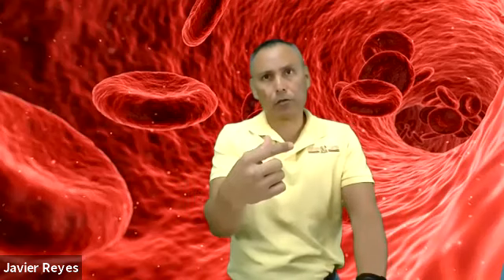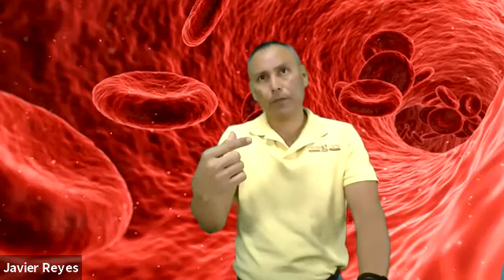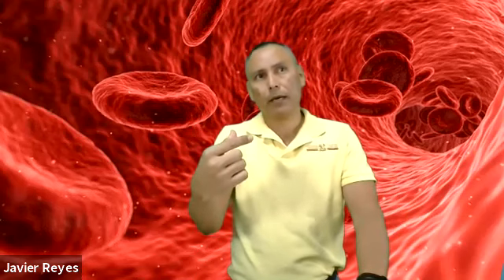If the bevel is completely through the vein, there is no blood flow. You can easily tell when you went through it, because there's no blood flow and you can tell that a lot of the needle has gone into the patient's arm. You're probably too far. So slowly come back, slowly come back, until you see blood return. If you see blood return, try to make the readjustment if possible. And remember, do not do any blind probing or side to side probing.